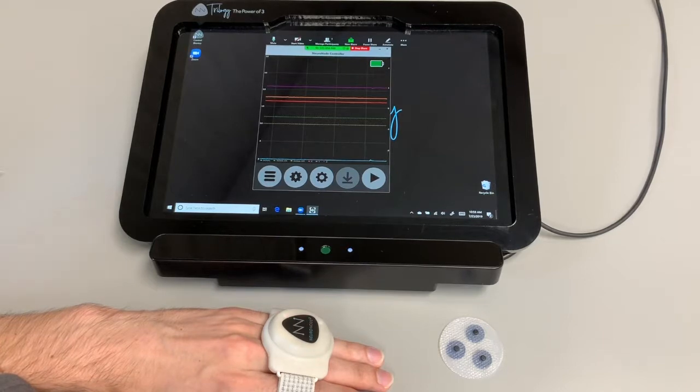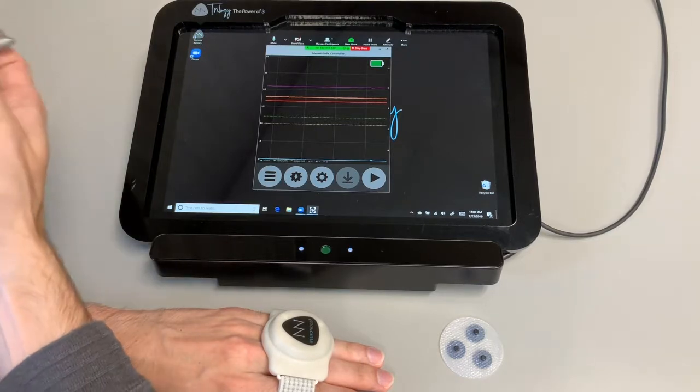Hey, this is Chris at Control Bionics. The video we're going to be doing today is going to be over the spatial control with the Neuronode. The spatial is something similar to how we have the setup for the EMG, but instead of reading the electrical signals, it's basically reading the movement that you have within the space — therefore spatial sensor.